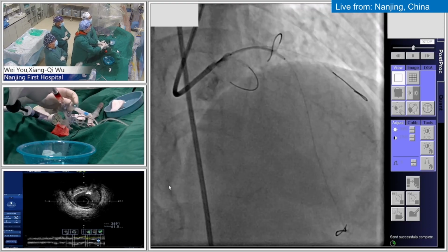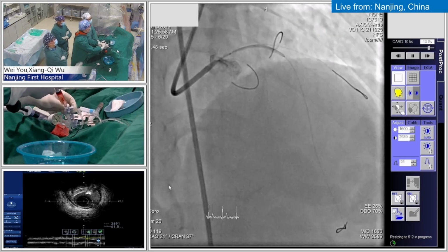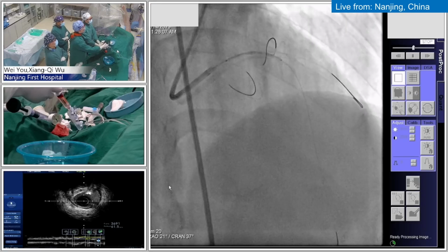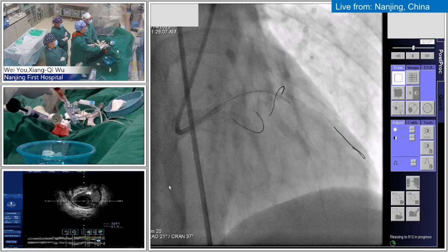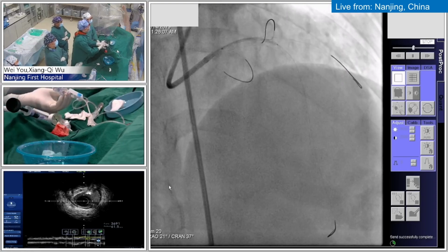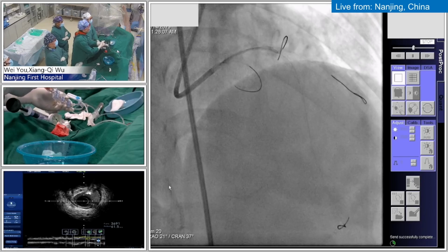How about here? Because I was just thinking about the ostium of the left main. Right. I just want 2 millimeters, to be sure, to come back a little bit. Okay, come back. Yeah. Agree with you. Okay. Yeah. Test please. Okay. Yeah. Okay. Maybe a little bit more now. A bit more. Okay. Test please. Okay. That looks all right.